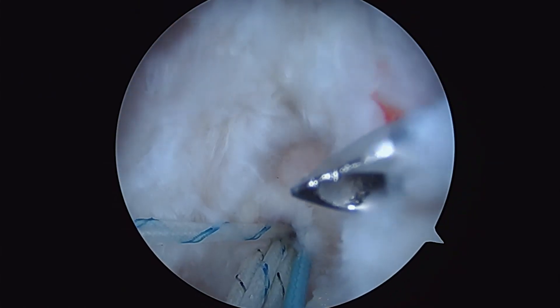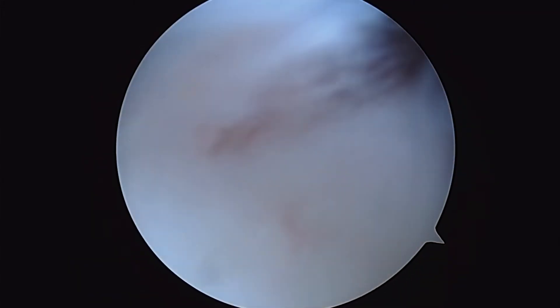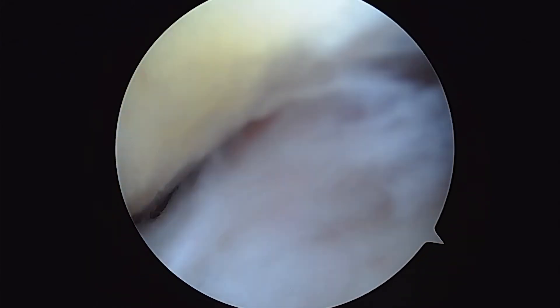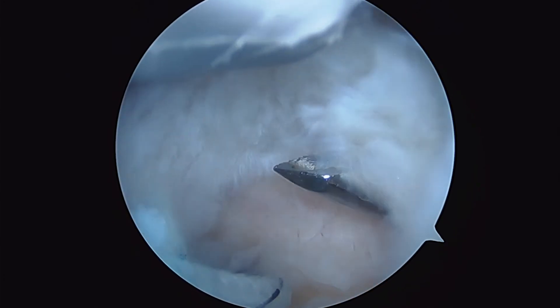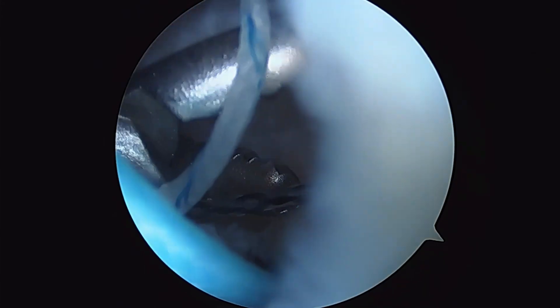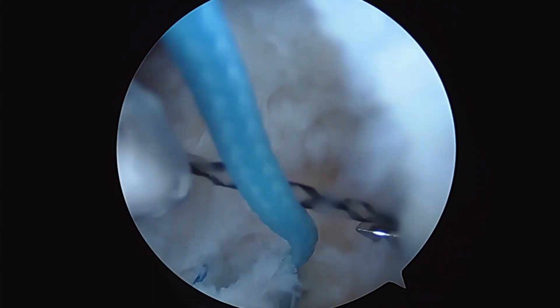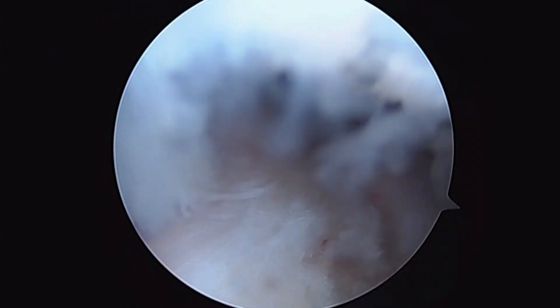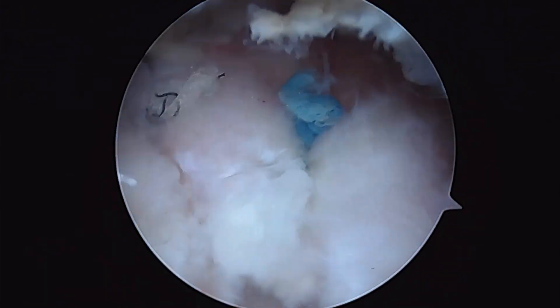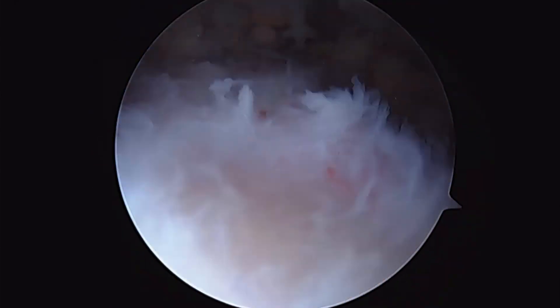We're going to basically try and place the stitch down about like that. Here you can see the needle coming underneath — we'll go ahead and feed the wire and then retrieve it. We're going to load the solid blue suture into the black wire right now. So we've got our three sutures in for the rotator cuff repair. We tied the biceps sutures too. We're going to finish up here and get you back to the recovery room shortly.